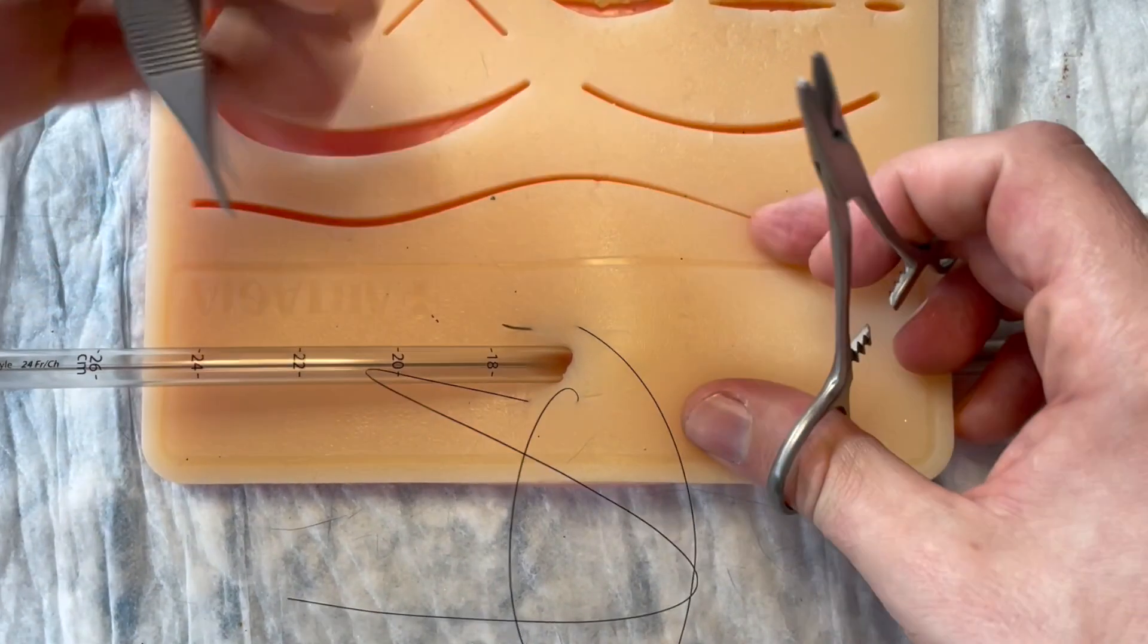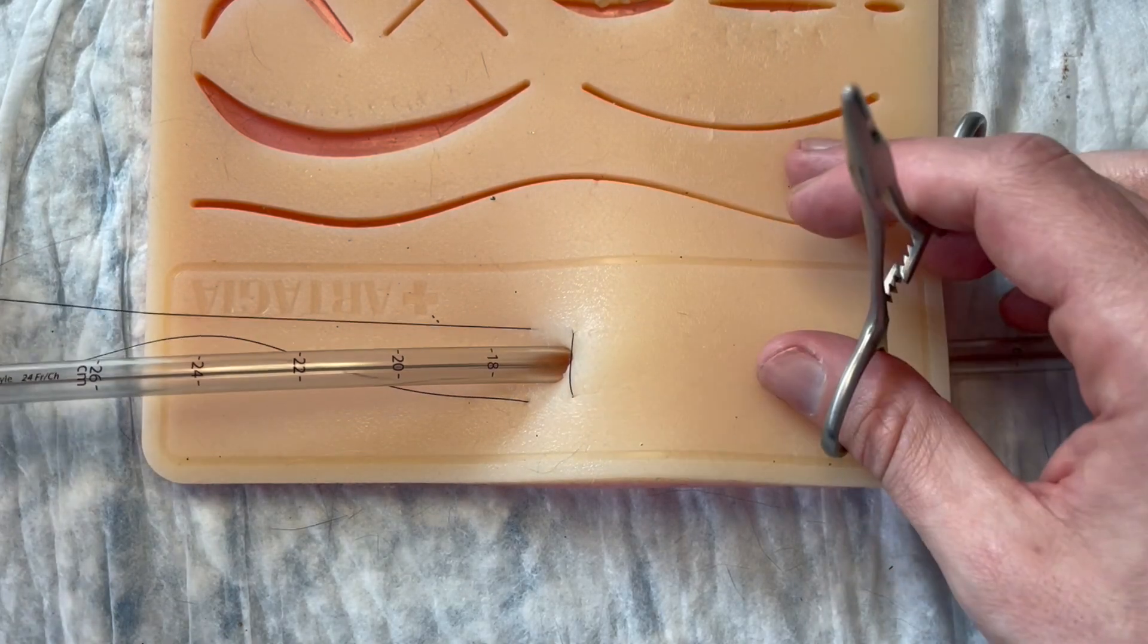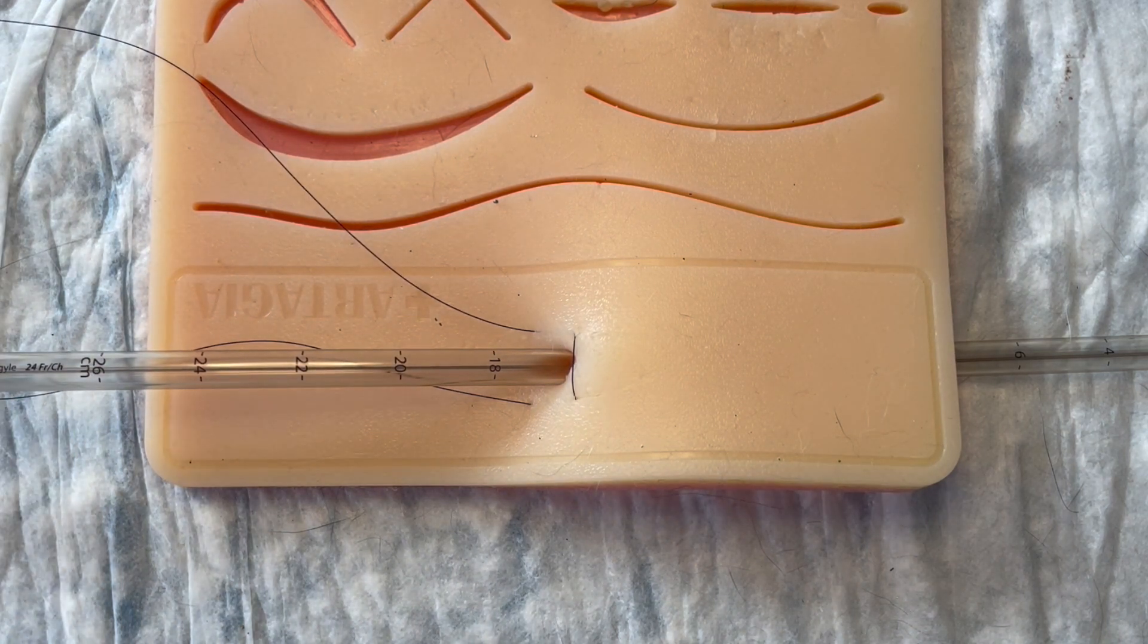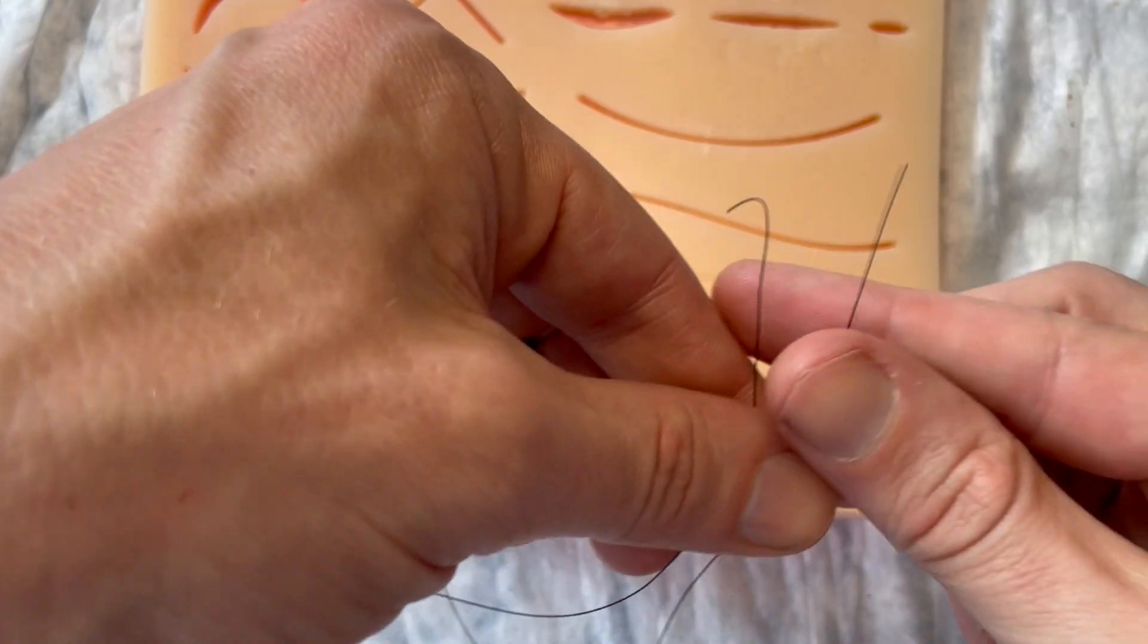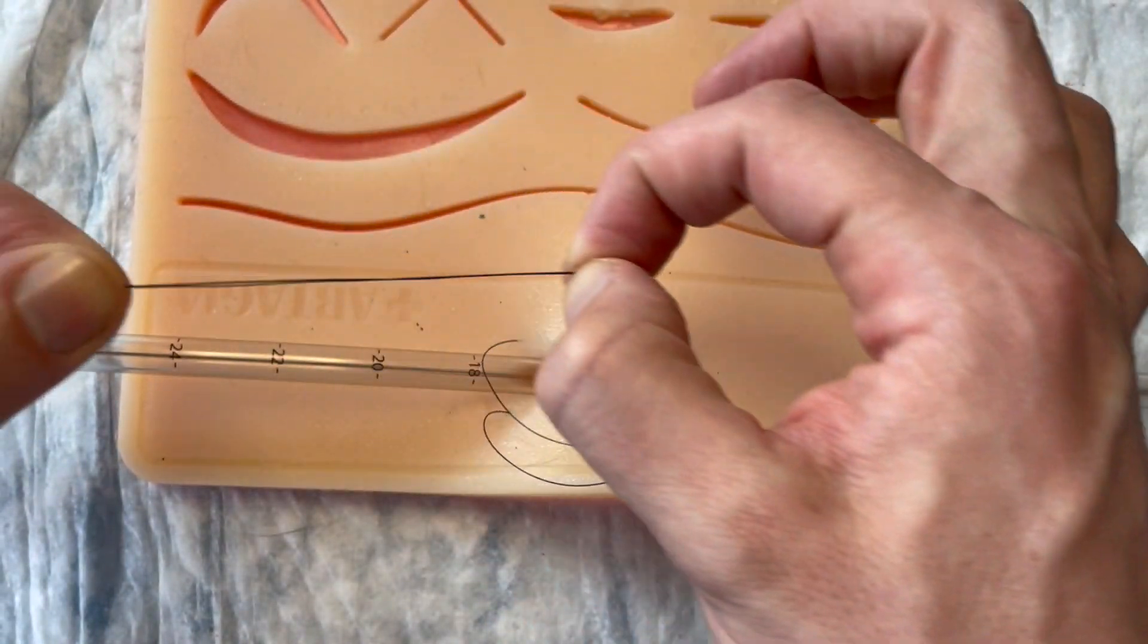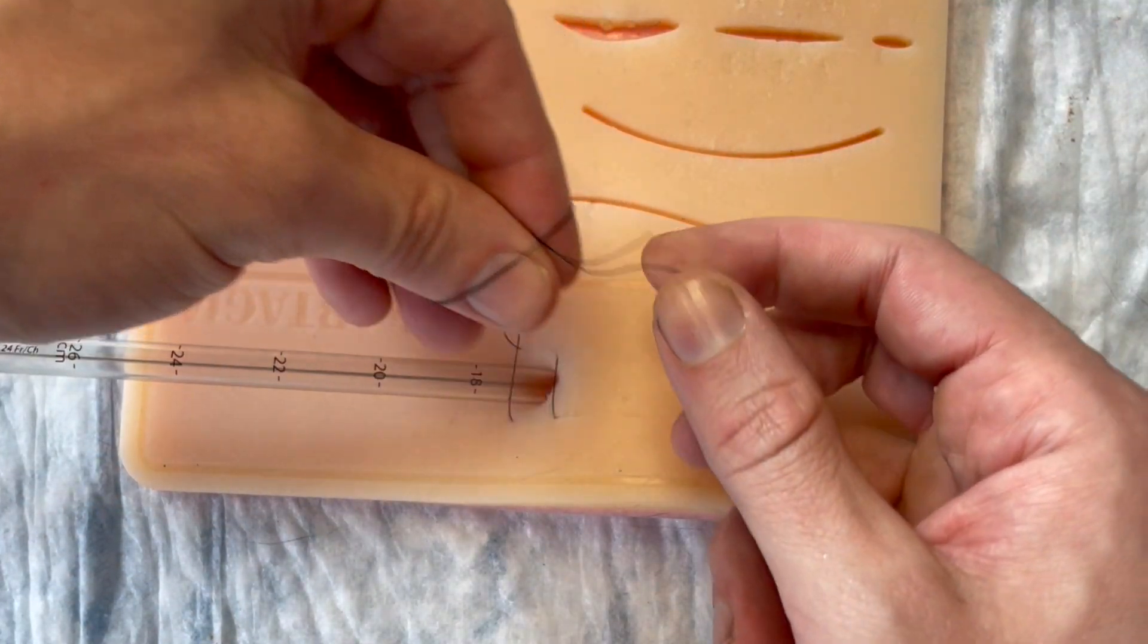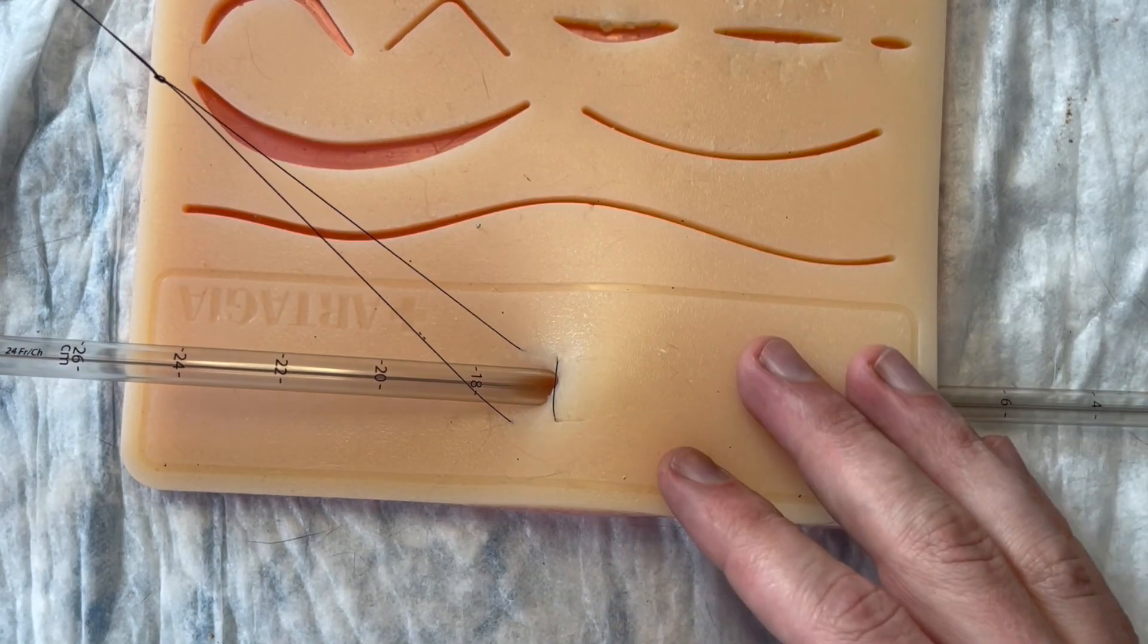Okay, so now we've got horizontal mattress that wraps around this tube. But once again we're gonna get rid of our needle here, so that is cut off. And now we're left with these two ends here. Line those up, straighten this out. Now I could either make a single knot and I want to make it about right in the middle, just do a regular tie and stop there, or I could be a little fancy and just kind of make a single knot like so.